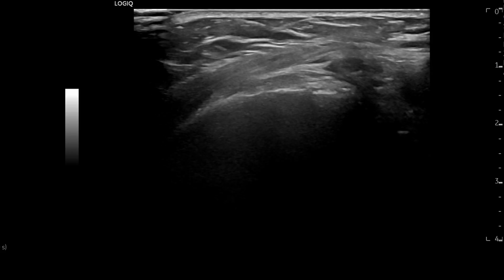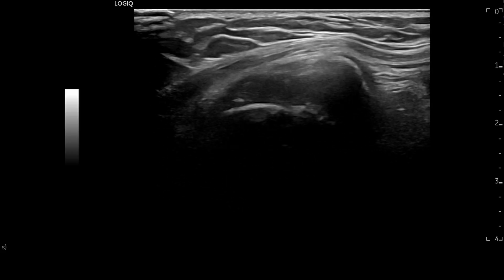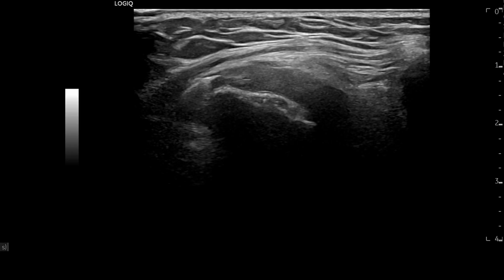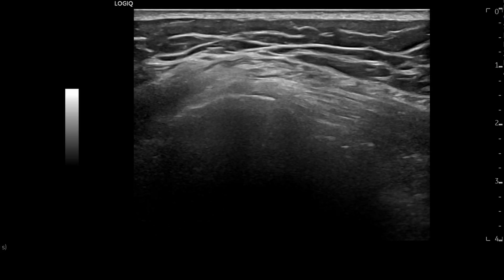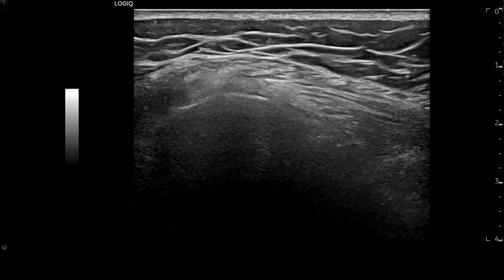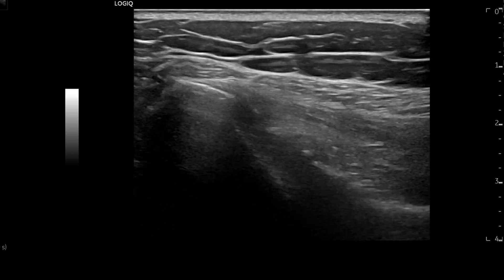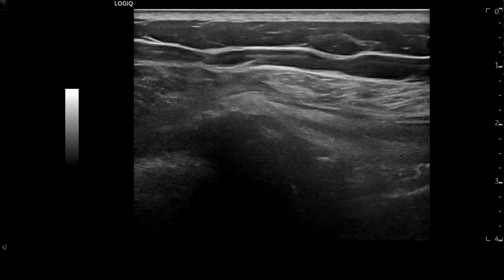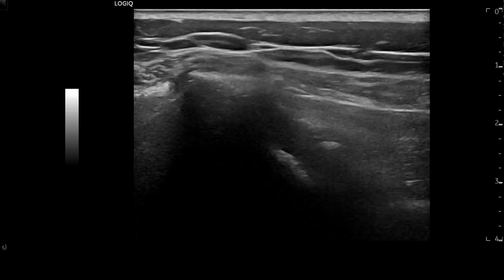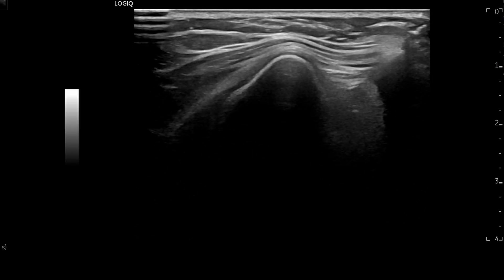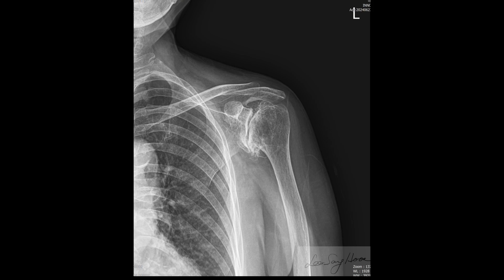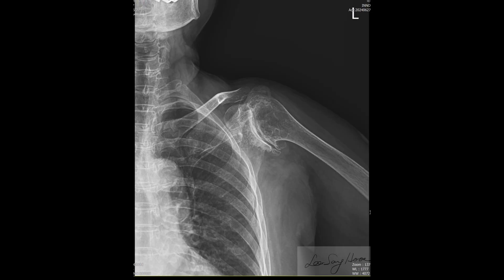The left side is the humerus, and the right bony cortical echo is the acromion. I can rarely observe the preservation of the supraspinatus tendon. The infraspinatus tendon and posterior joint are easy to observe because there is no covering bony structure. I found an osteophyte at the posterior margin of the scapular articular process, or ossification of the posterior glenoid — these findings are common ultrasound features of advanced glenohumeral osteoarthritis. A simple x-ray is sufficient for diagnosing glenohumeral osteoarthritis, but I use ultrasound to detect the amount of joint fluid or subacromial effusion and to assess the intactness of the rotator cuff.